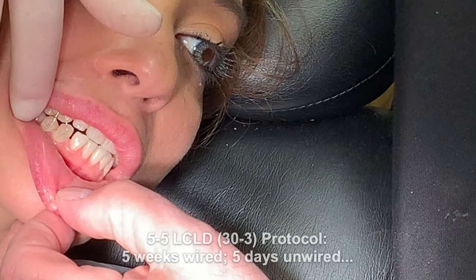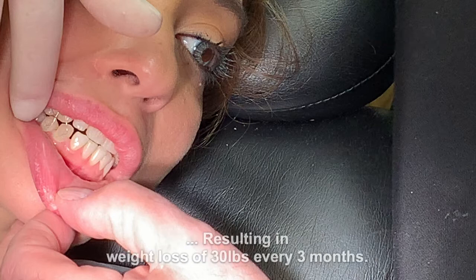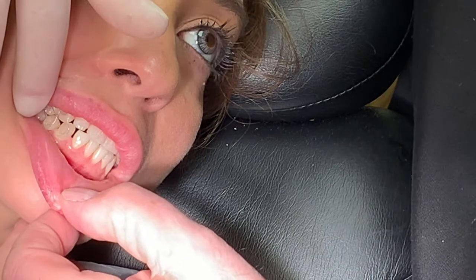She will be following the 5-5 LCLD OJW protocol, 5 weeks wired, 5 days unwired, on a low-calorie liquid diet, and consequently will lose 25 to 30 pounds every 3 months. That's the envelope of motion. That's what the wire lets you do.